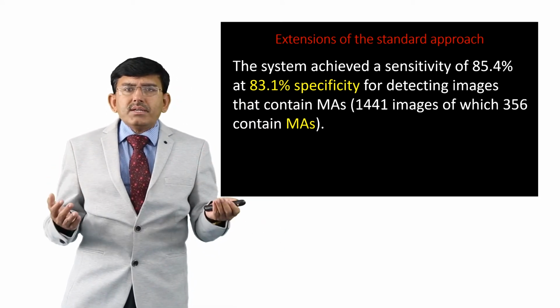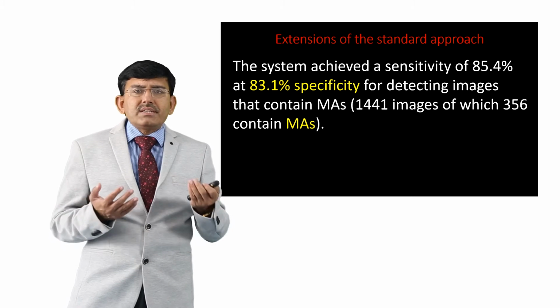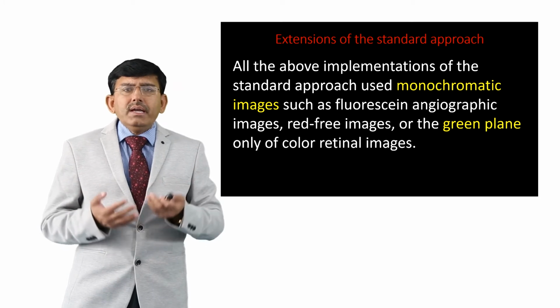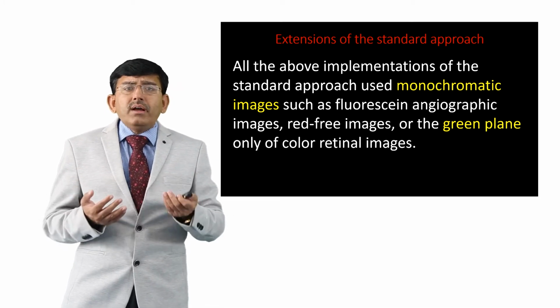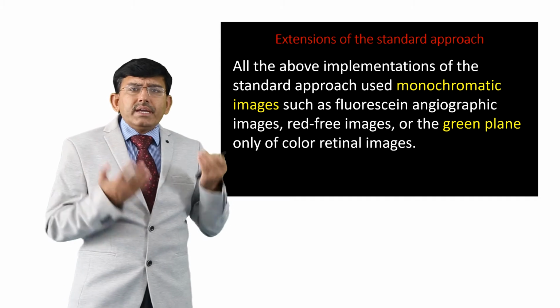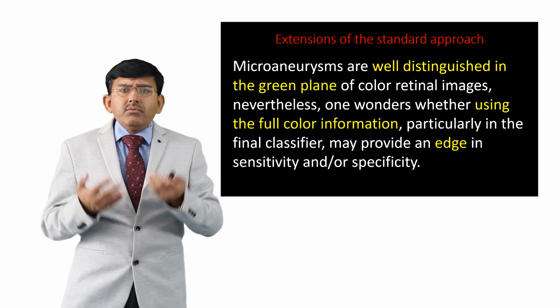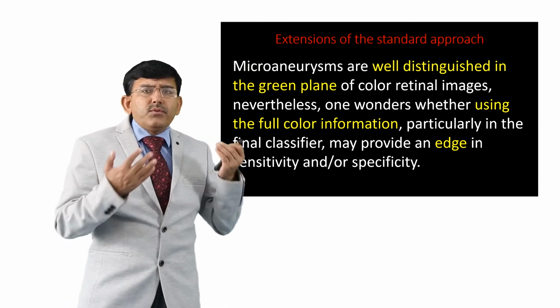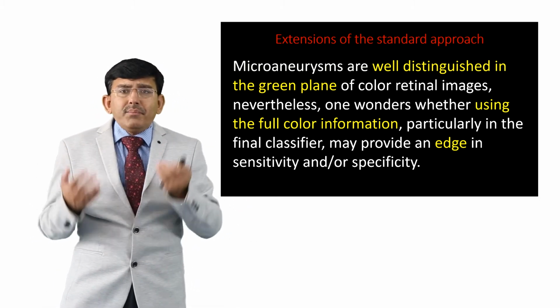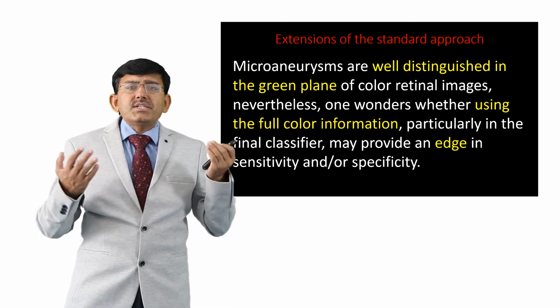All the above implementations of the standard approach used monochromatic images such as fluorescein angiographic images, red-free images, or the green plane only of color retinal images. Microaneurysms are well distinguished in the green plane of color retinal images. Nevertheless, one wonders whether using the full color information, particularly in the final classifier, may provide an edge in sensitivity and/or specificity.